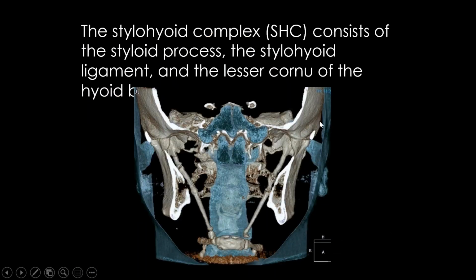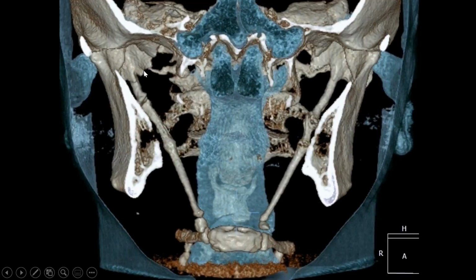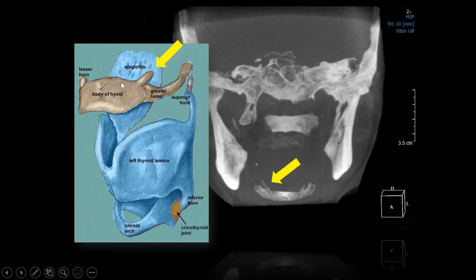The stylohyoid ligament complex actually has 4 segments to it. I showed you this one last week, and all segments are calcified bilaterally with this patient. And you can see a much larger image here, right from the styloid process down to the hyoid bone. Now, one of the things that you'll need to understand is that the thyroid cartilage down in here is actually suspended from the hyoid by ligaments. So you'll see on your sagittal views the superior horn of the thyroid cartilage, and it'll be calcified, and even the ligament can calcify.